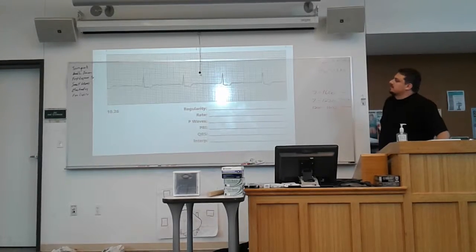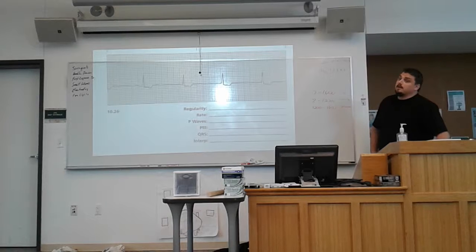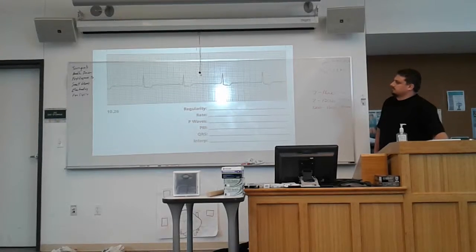Okay, so could this be a second degree type 1? No. Why not? There's no drop beat. Okay, so what about a type 2? No. Also no drop. Wait, why are you saying no to the type 2? I'm not following. Well, also the P's all march out.